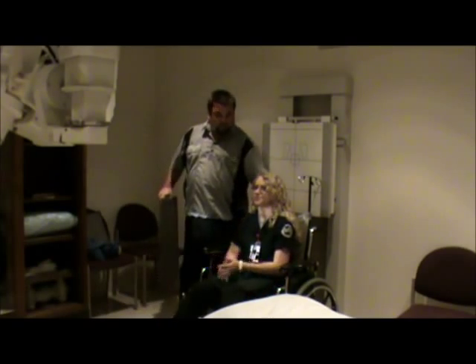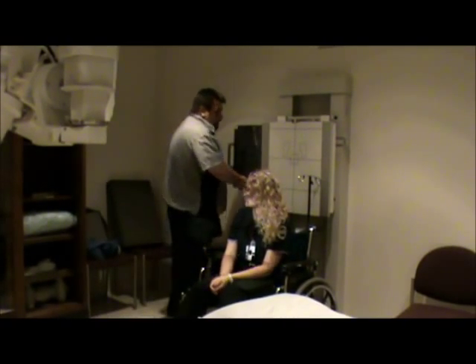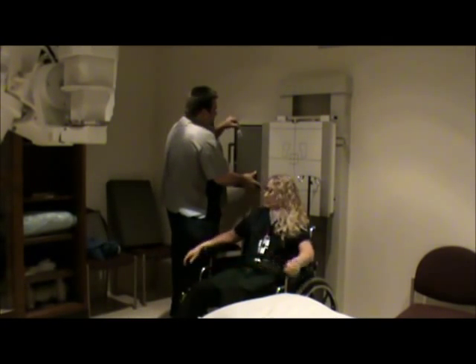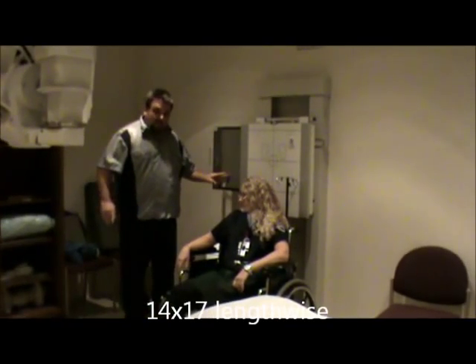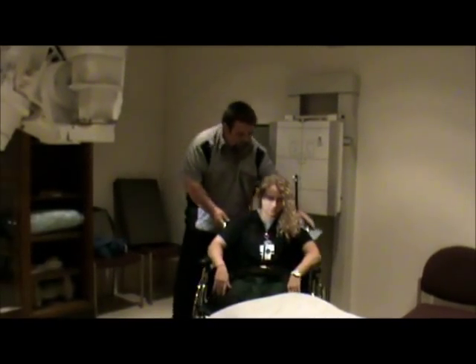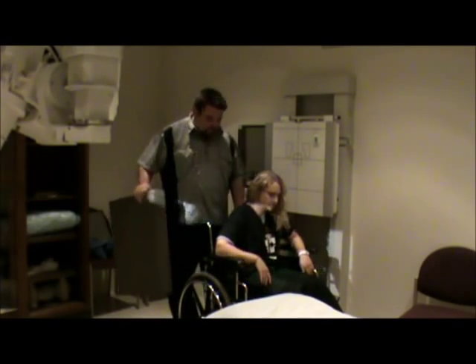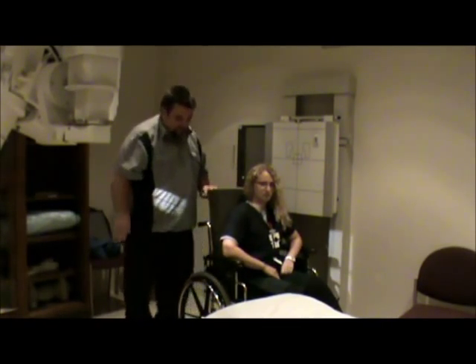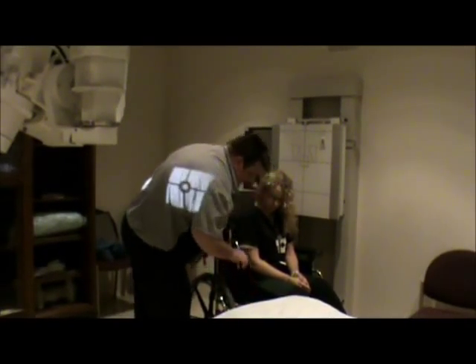Now we're going to do our lateral chest X-ray. We're going to do this in the upright bucky. The film will be lengthwise for the lateral. We'll turn the patient. I'm going to use a sponge behind the patient's back so she leans forward — that way we try to keep the wheelchair out of the way. On wheelchairs that do have removable handles, we do want to take them out.